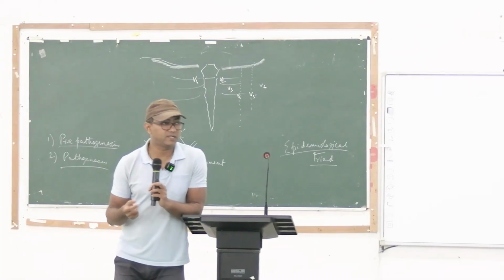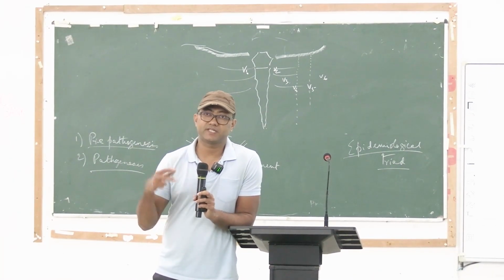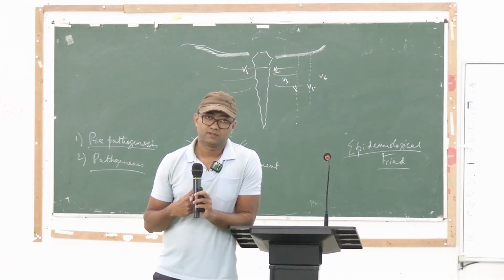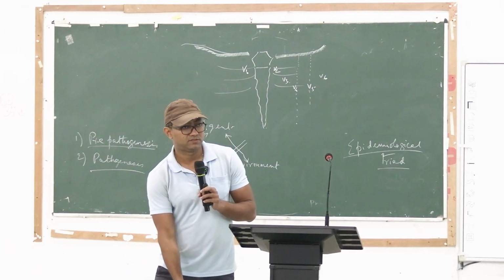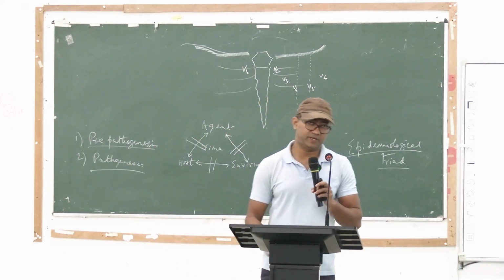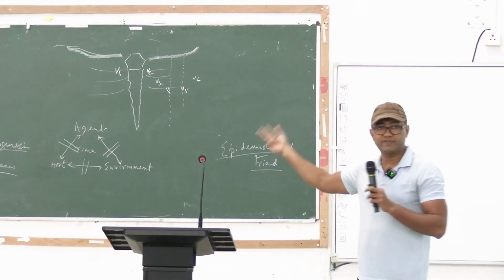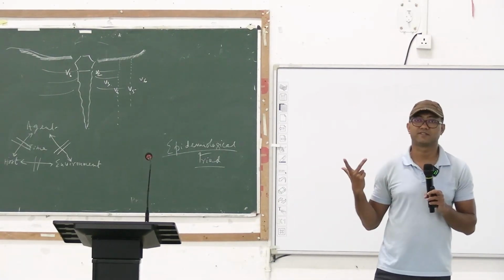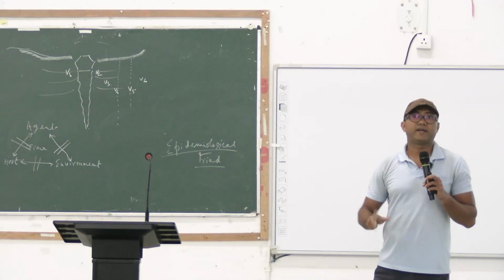Take any lead of the ECG, it measures potential difference between 2 points. In case of lead 1, it measures potential difference between your right arm and left arm. In lead 2, it measures potential difference between right arm and left foot. And similarly, lead 3 measures potential difference between left arm and left foot. What about leads V1, V2, V3, V6? V1 measures potential difference between which 2 points? One point is definitely the position of V1. Where is the other point located?